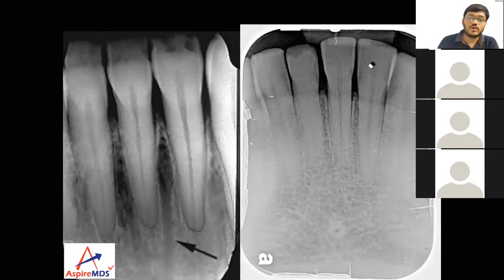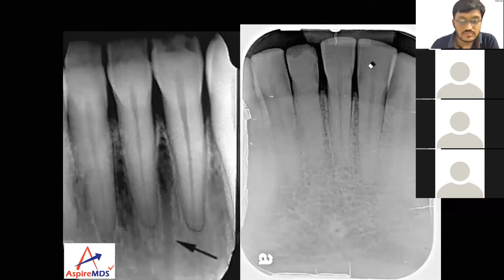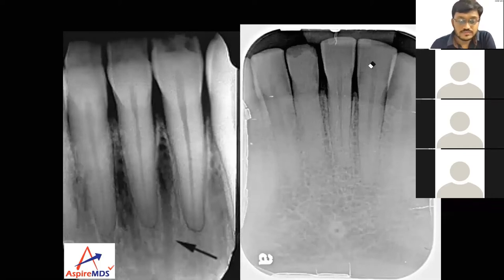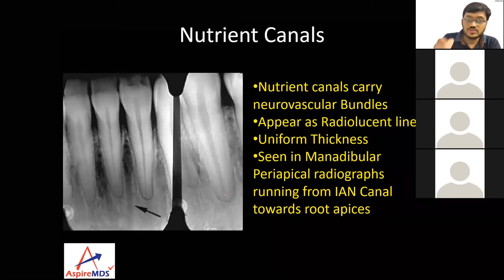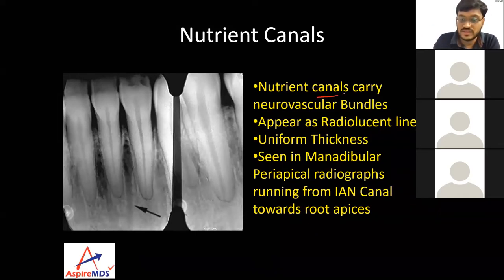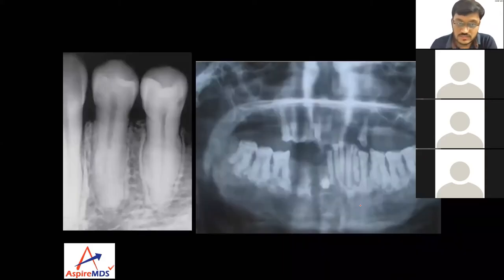In this radiograph, the finding indicated by the arrows is nutrient canals. Histologically these are called Haversian canals, and radiographically they are known as nutrient canals. These canals carry neurovascular bundles, appear radiolucent, have uniform thickness, and are seen in mandibular periapical radiographs running from the inferior alveolar canal towards the root apices.